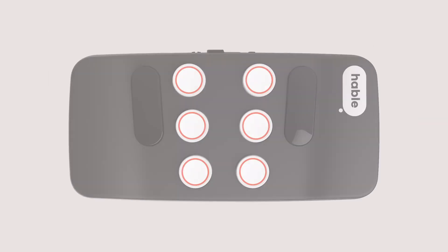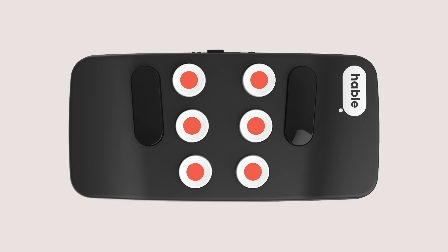To make sure your Hable is in the correct mode, enter the Hable menu by holding the six round buttons. For iOS mode, press and hold dot 2, feeling two vibrations. And if you're an Android user, press and hold dot 1 until you feel three vibrations.